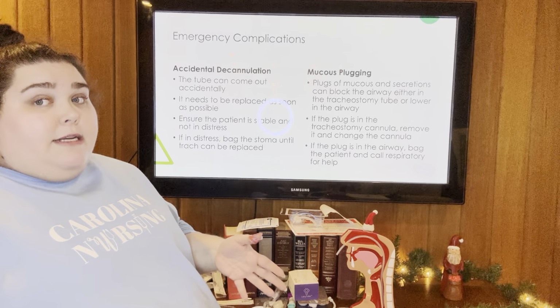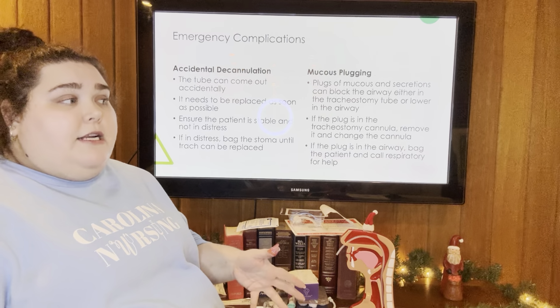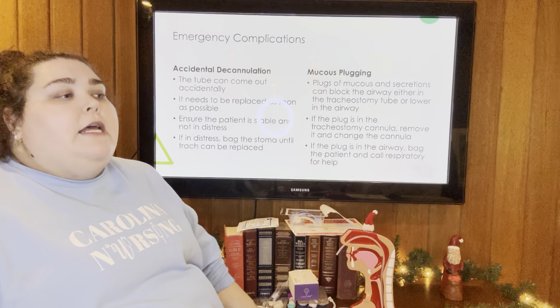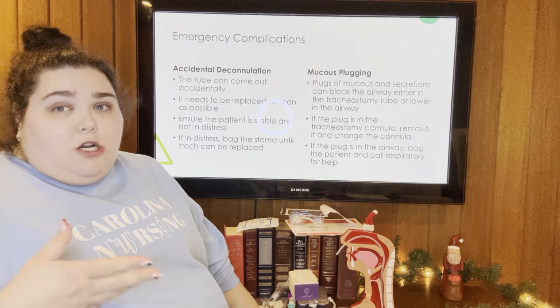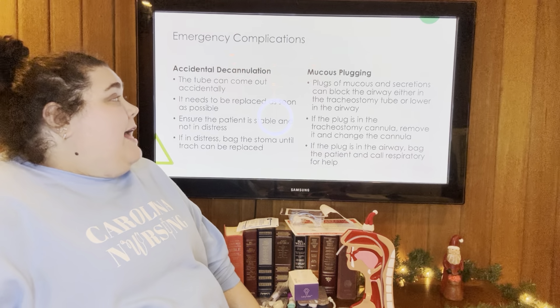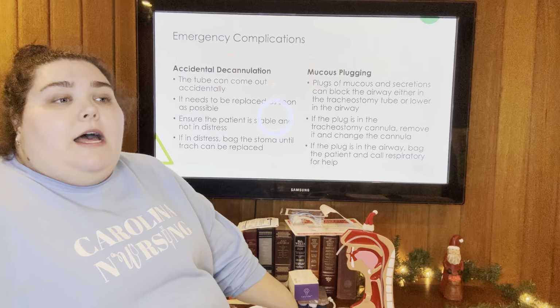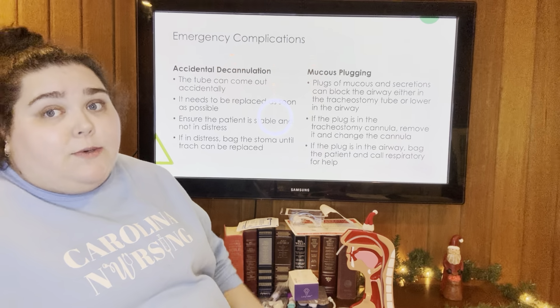The first step is to ensure that the patient is stable and in no acute distress. If they're not in any distress, then you can take your time and breathe and center before you start trying to put the trach back in. You can be a little bit more cautious and just take your time. If the patient is unstable and they're really desatting, then you just got to get it in, down and dirty. And that's not anyone's preference, but if that is the case, you got to get it in as quickly as you can.